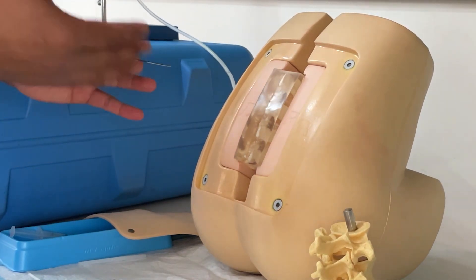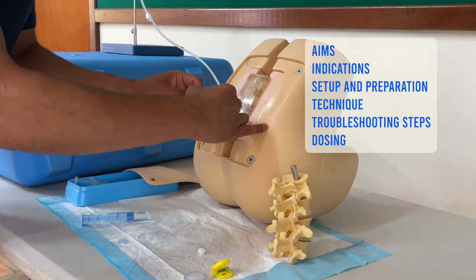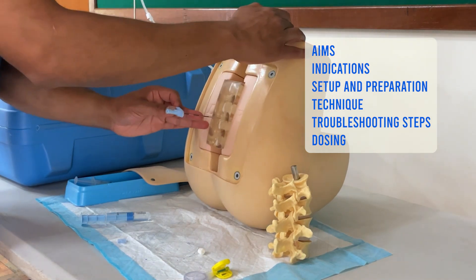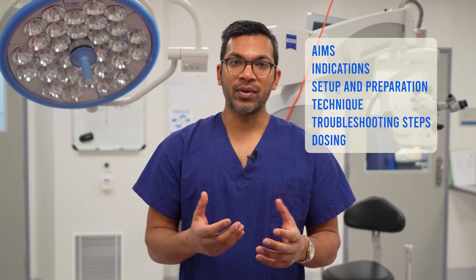Today I want to go through a whole bunch of stuff including the aims and indications, the setup and preparation. I want to go through a lot of detail on the technique and also show you what the technique looks like with the skin removed, so you can really see what the anatomy looks like and how this technique can be challenging. I'll try to go through a few troubleshooting things for the difficult epidural and finally how to dose the epidural for labour, anesthesia, and analgesia. So let's get started.